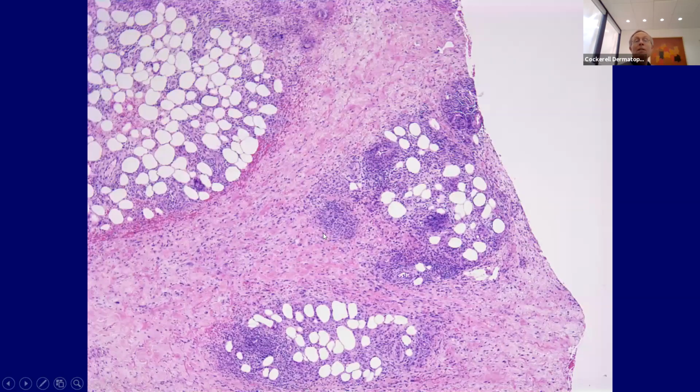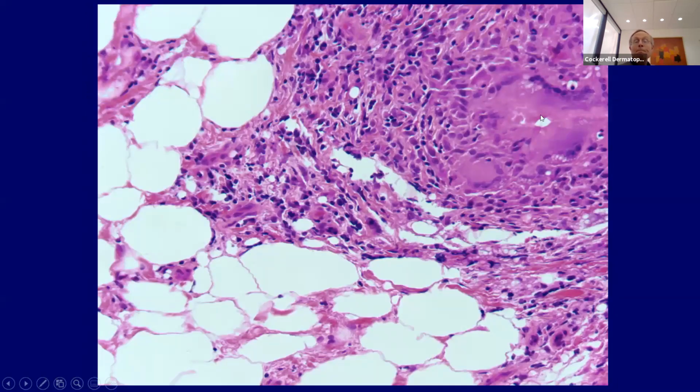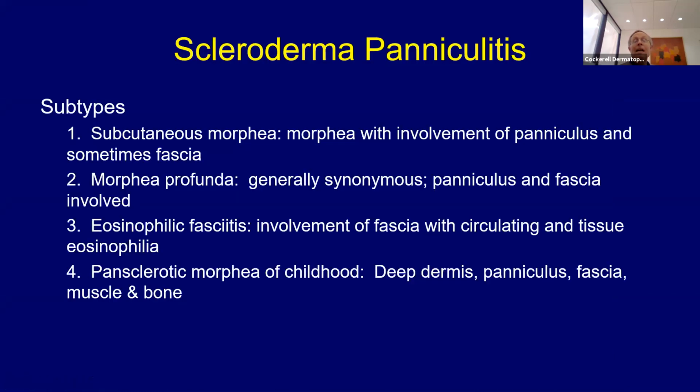And as you go to higher magnification, it's an admixed infiltrate. There's some histiocytes here. There's some neutrophils. So it's got this granulomatous, mostly septal panniculitis. There's a multinucleated giant cell right there. So again, this doesn't give you that classic so-called Miescher's granuloma appearance. Again, I don't think you really need to focus on that. Just remember that it's mostly septal, mostly involving a little bit of the lobules at the periseptal area here with granulomatous inflammation. So again, nice example of Erythema Nodosum. And this does not have a vasculitis with it. So it's a non-vasculitic, mostly septal panniculitis.